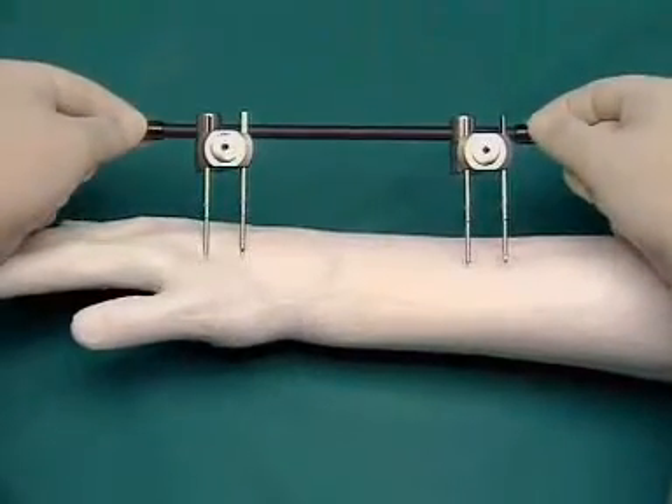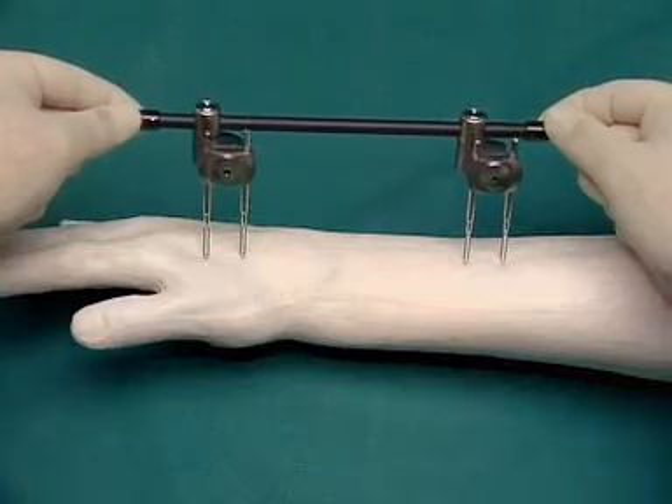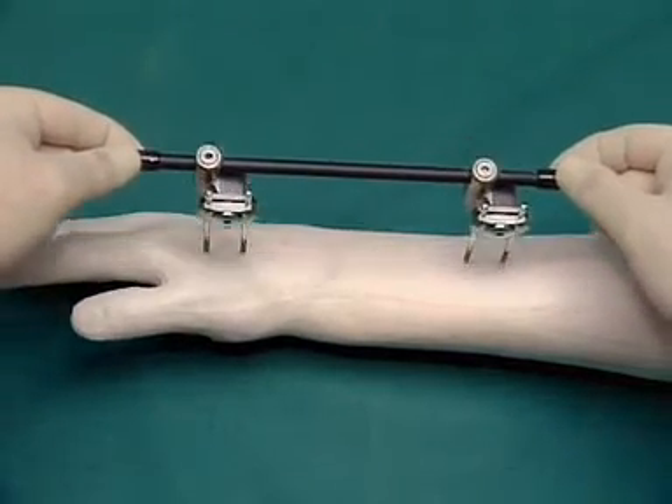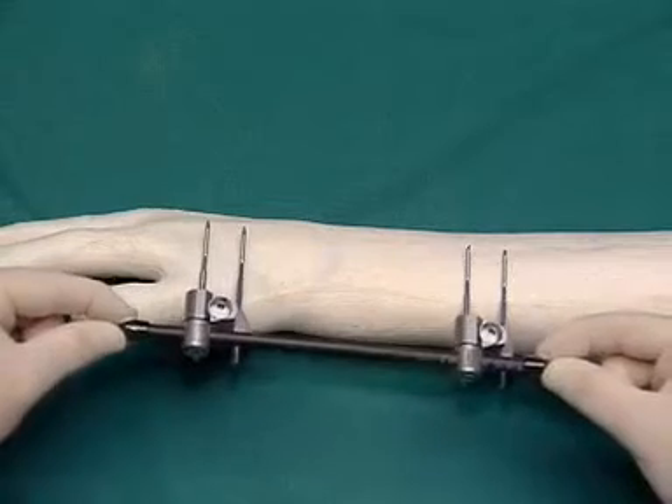Here the external fixator is pre-assembled for demonstration purposes. For the definitive assembly, the Schanz screws have to be inserted at an angle of 45 degrees from the dorsal radial direction.